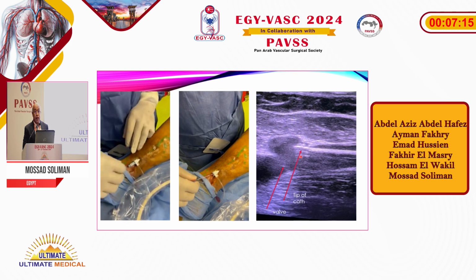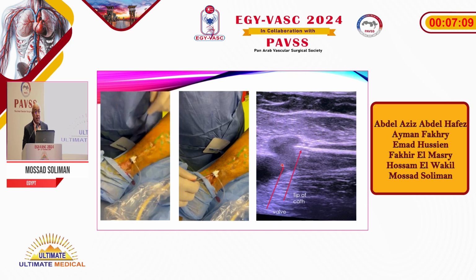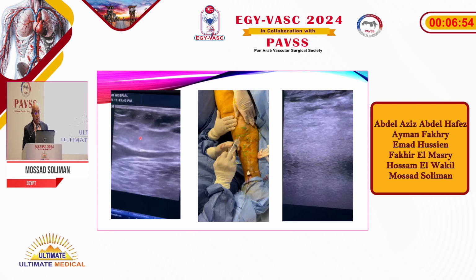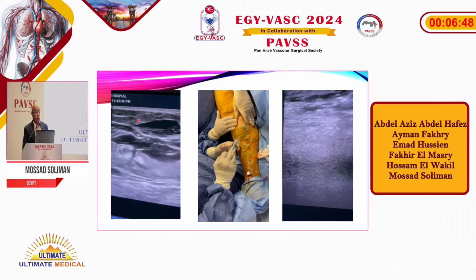We have a study showing that zero-point ablation at the saphenofemoral junction is as effective, and it doesn't induce any kind of DVT in case of radiofrequency ablation. This is followed by tumescence at the saphenofemoral junction, and this tumescence will ensure a very good distance of around 3 centimeters away from the skin, just to avoid any kind of burning.